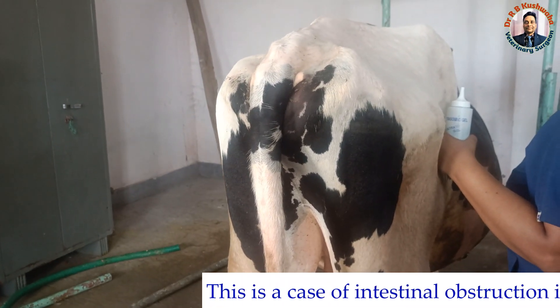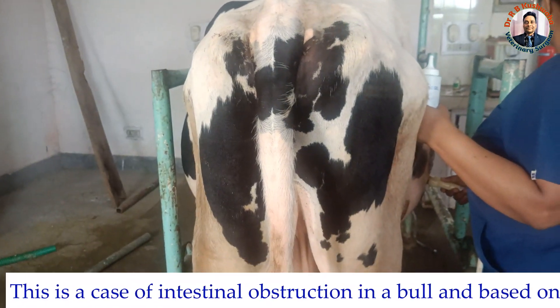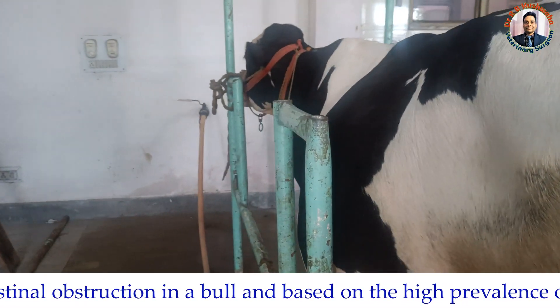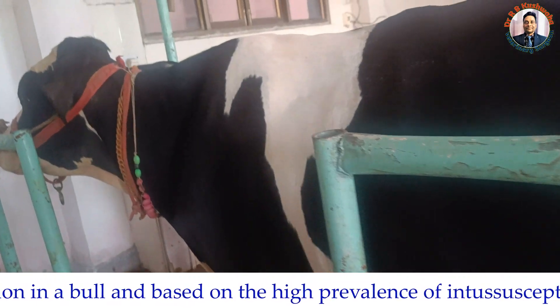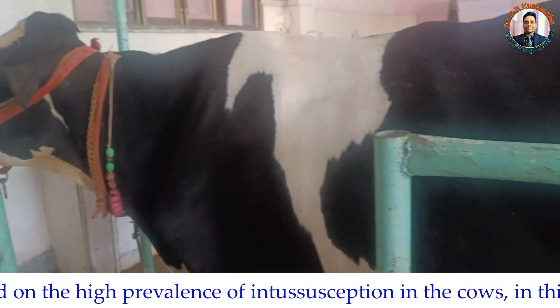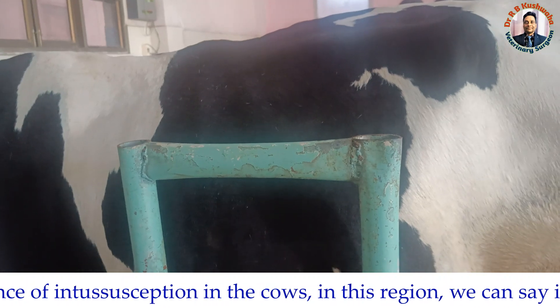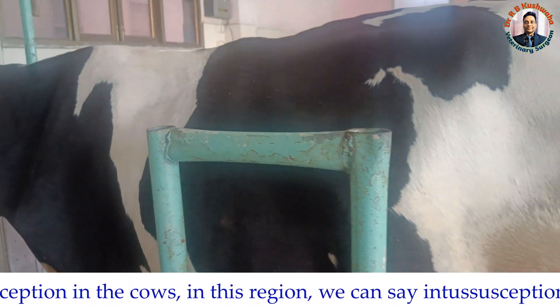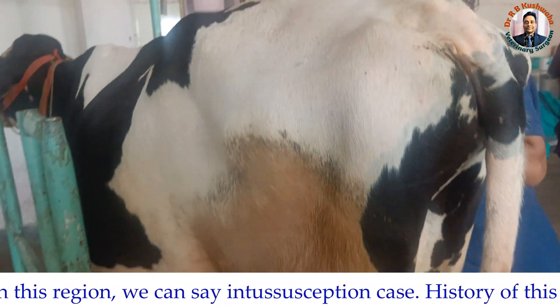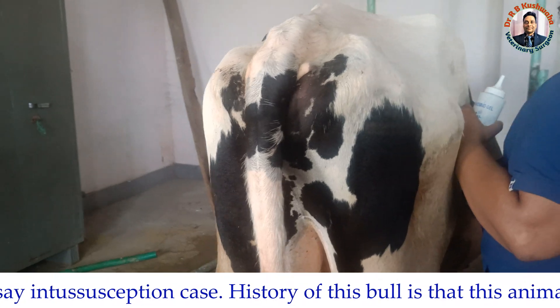Today we have a suspected case of intestinal obstruction in a bull. Normally here we are getting cases in the cow. The history of this bull is that the animal had severe colic signs four days ago, and from the same day also stopped taking feed and fodder, and has also not passed feces.